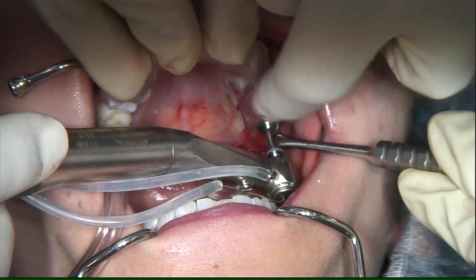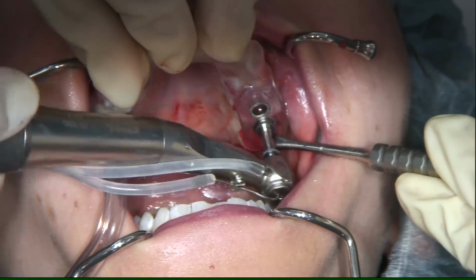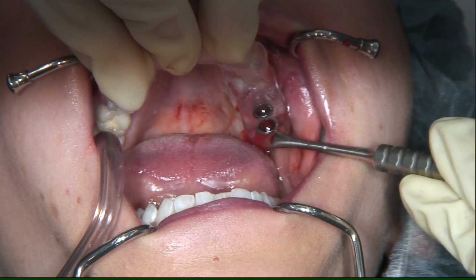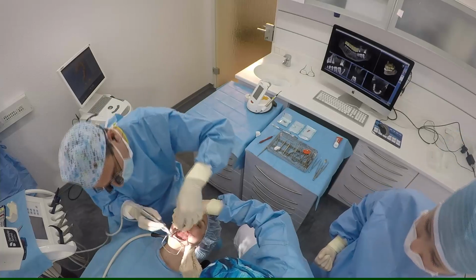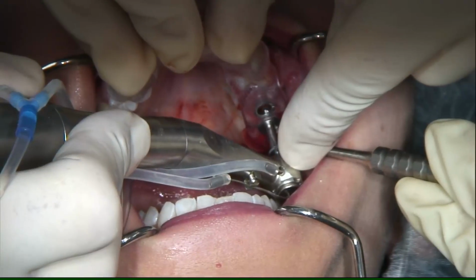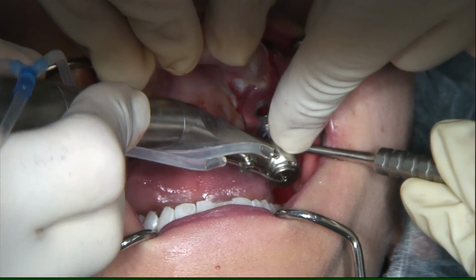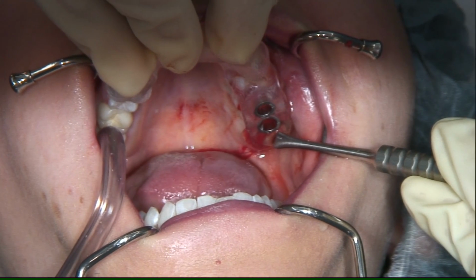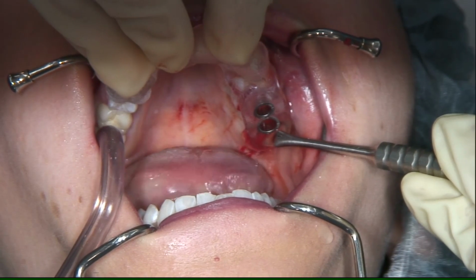Now 3.4 millimeters, you see it at the gray color of the drill. In the maxilla, in most cases we have less density than in the mandible, so the bone is a little bit weaker. For this we need an implant design which gives us a good primary stability, like Xive.